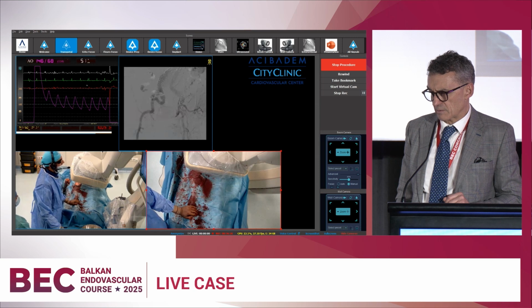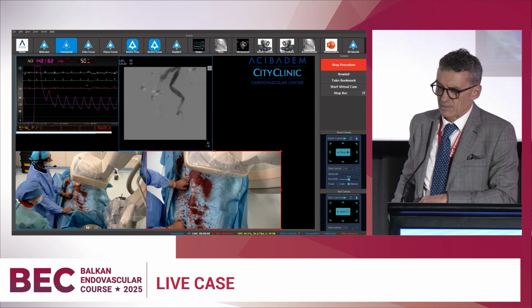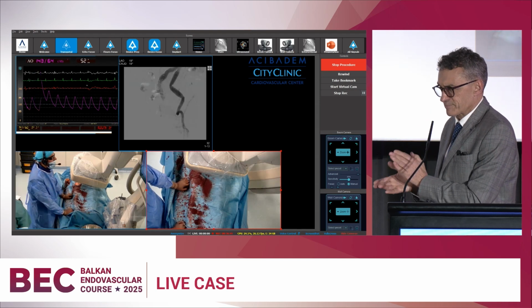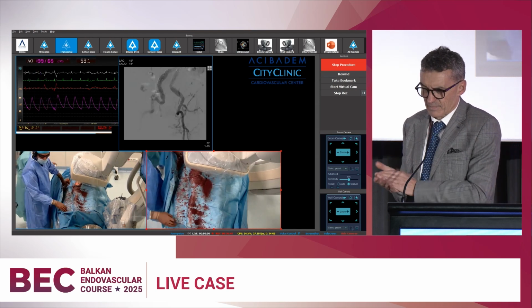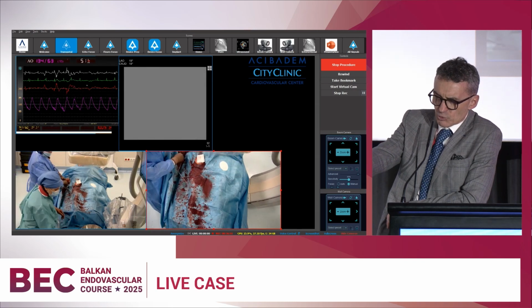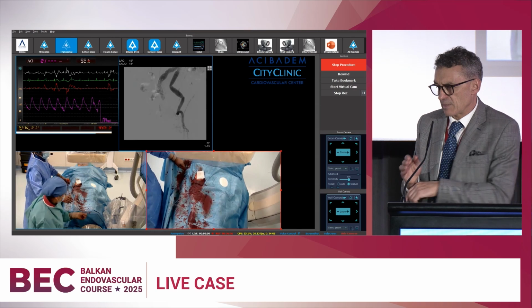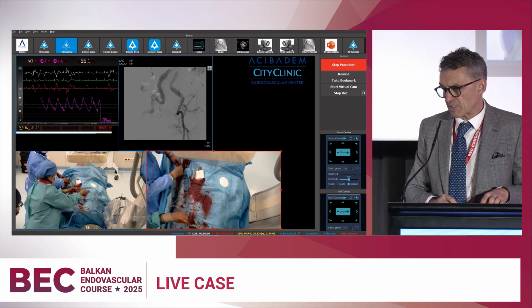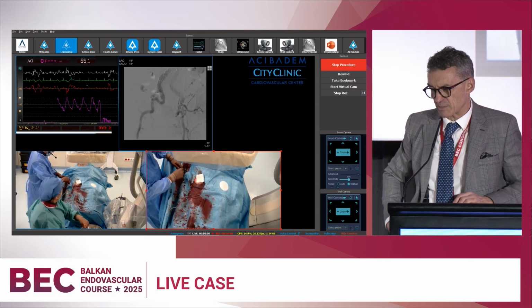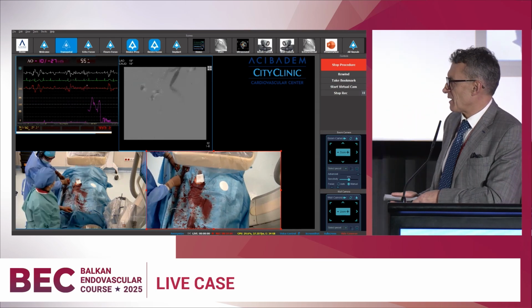Very good. I think that everything is okay. In fact, it's not okay, it's perfect. Congratulations. Thank you. Thank you, everybody. You can appreciate the huge tortuosity. You see? It's a huge tortuosity. Together with surgical connective tissue there, it's a tough case. Okay, great job, Zorana.